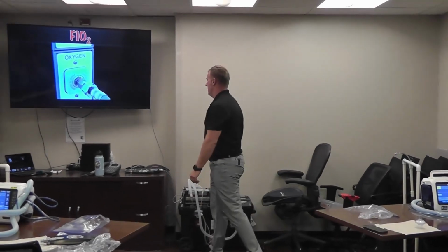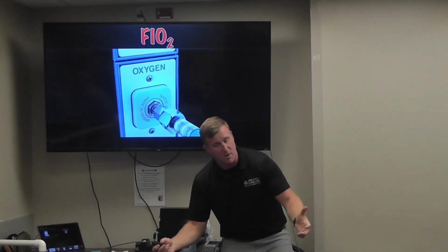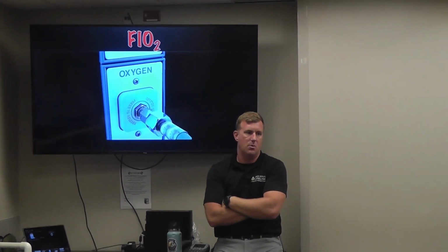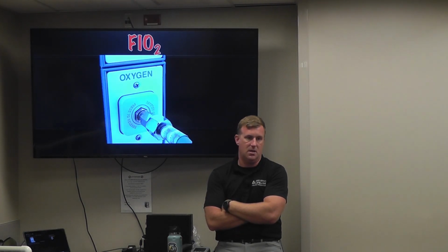Okay. Next on the list is FiO2. Okay. So the amount of oxygen we're giving. All of you guys are running 21% right now just because we don't have an oxygen source on here, but we typically don't run 21%. My low end is about 30%. If you're going to come for a ride with me, you're getting 30% FiO2. But it is not uncommon for us to find patients on 100% FiO2, and they will have been that way for a long period of time.